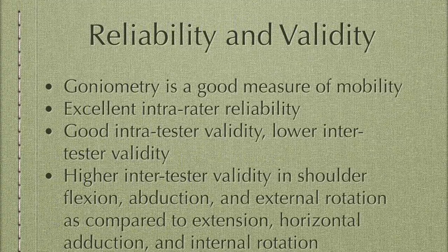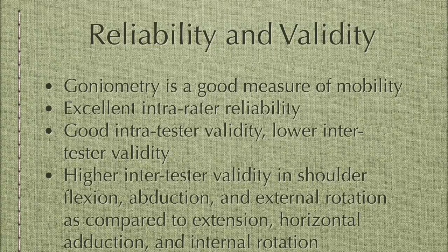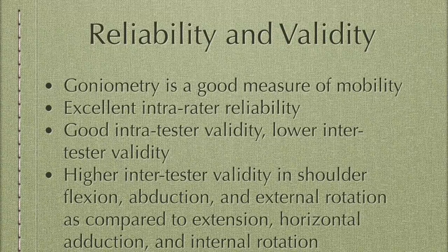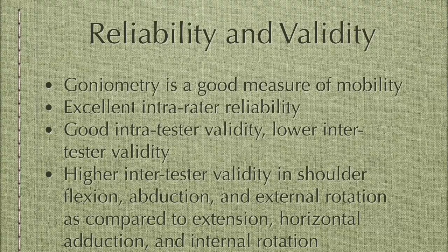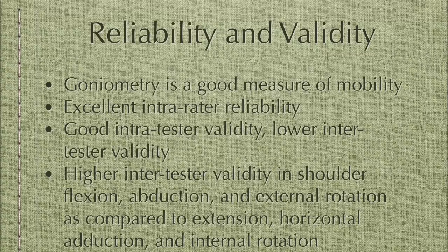According to research published in 2012, Kolber and Haney found that goniometry was a good measure of mobility, as excellent intra-rater reliability was demonstrated for goniometry in the shoulder. Validity for intra-tester is good, while inter-tester validity is a bit lower.